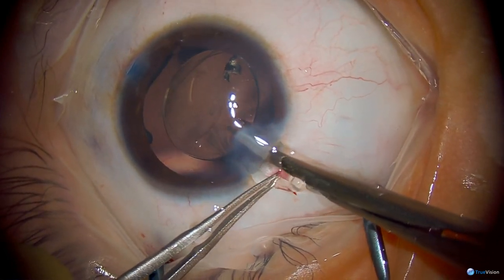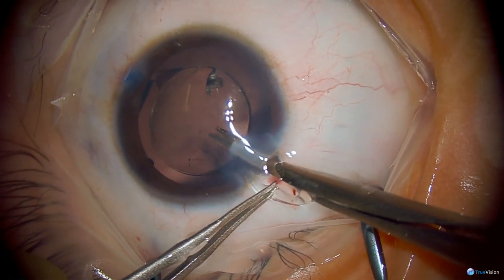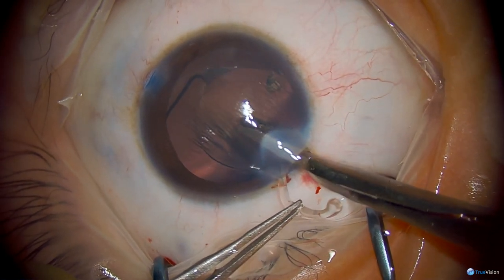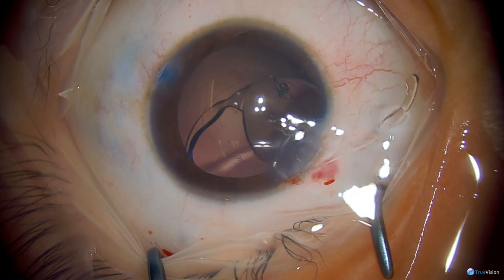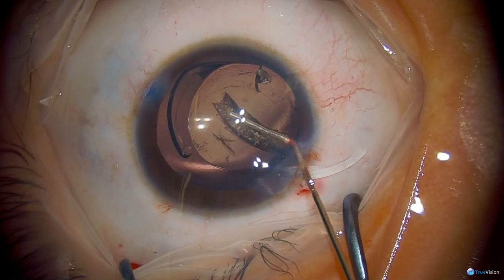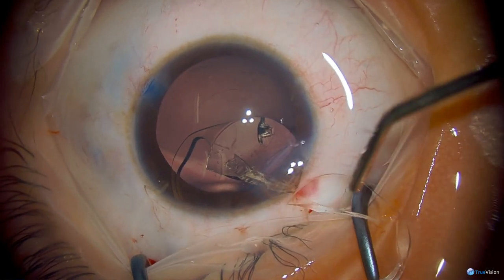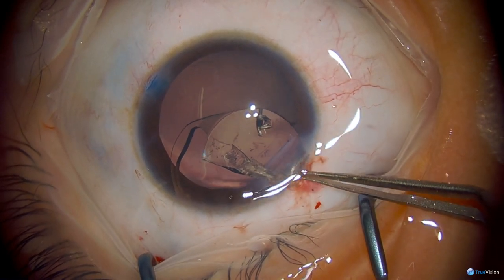I think this is a good illustration of how explantation is most easily done: grasping that haptic and cutting directly underneath the haptic that is in your forcep while it's outside the wound. These are simple Vannas scissors. Trying to cut across the mid portion of the lens, extending from behind one haptic to behind the opposite haptic. That'll give you two roughly equivalent halves, each with a haptic as a handle to guide them out of the incision. If you don't cut underneath the haptic, you have a hard time removing those fragments.